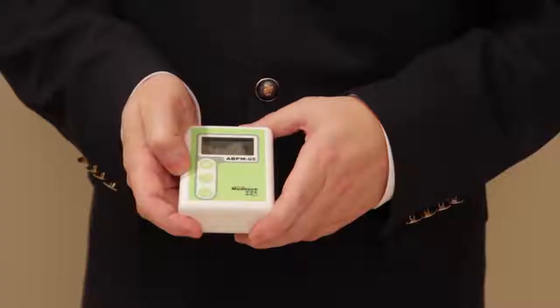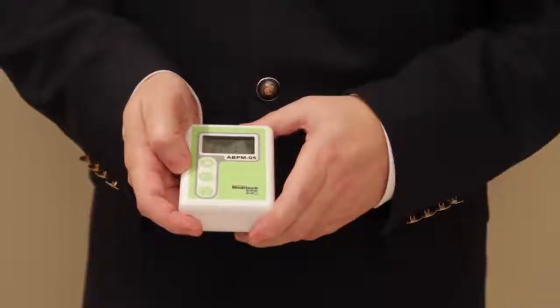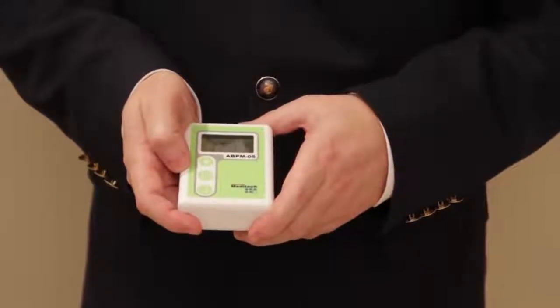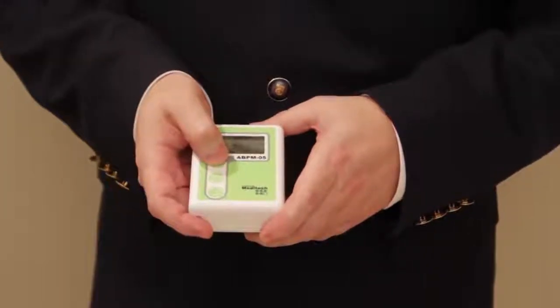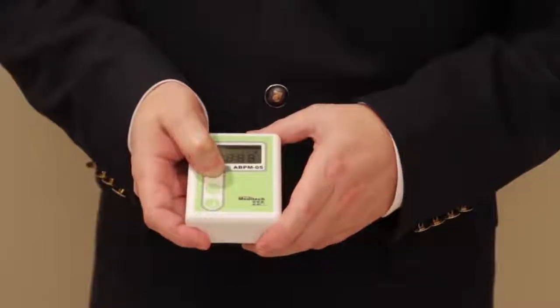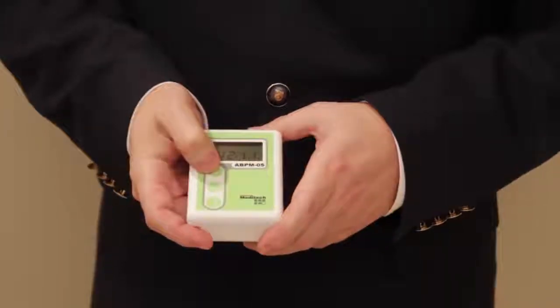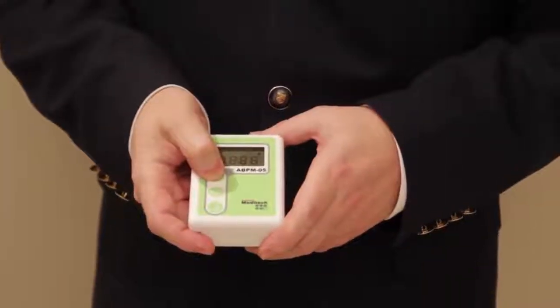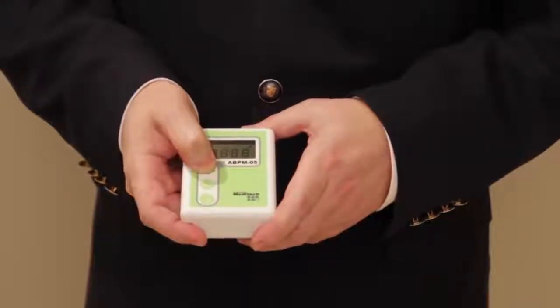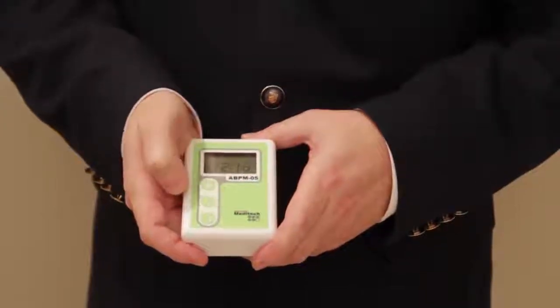So once batteries are inserted, you may not have enough time to check battery voltage on the display. So you can check battery voltage anytime by pressing and holding the start button for at least 5 seconds. Now the LCD will show all segments, and then it will show battery voltage like this. Press, keep it held, wait a little, and now this shows the battery voltage. Release.